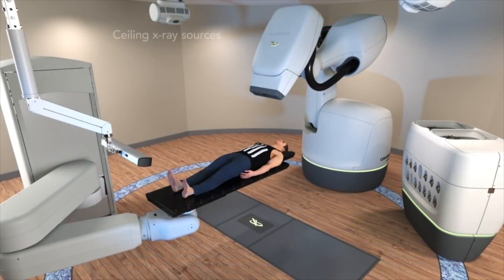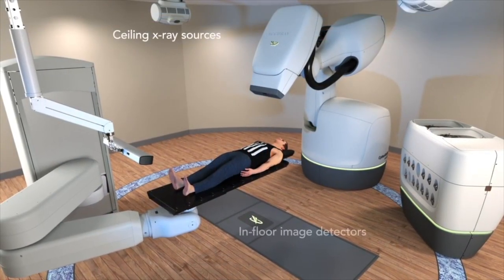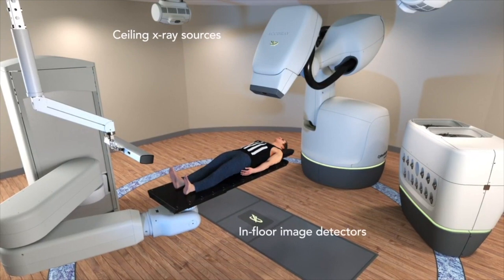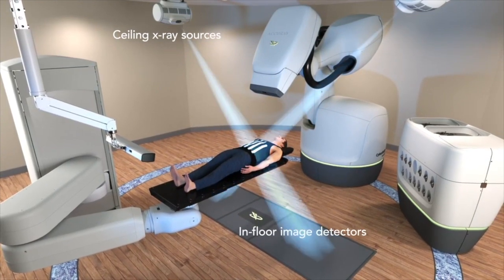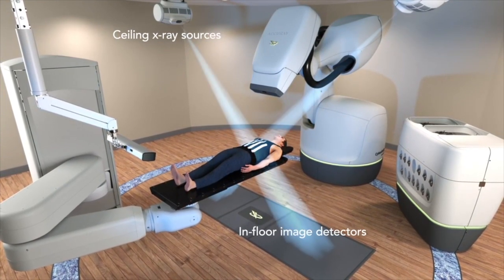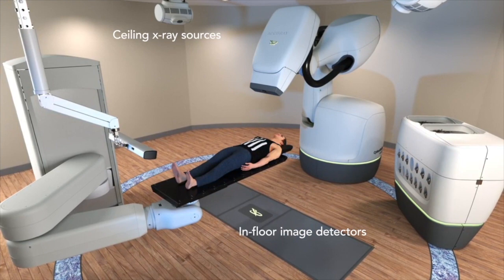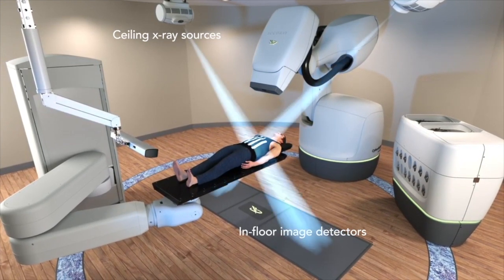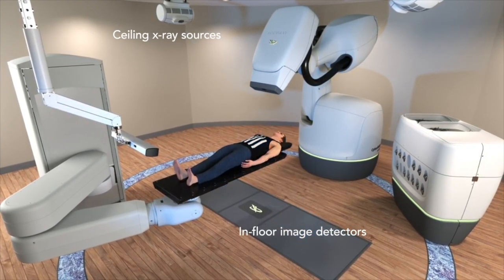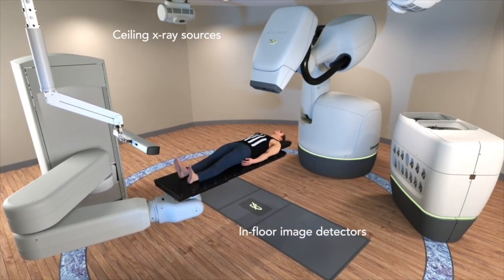The CyberKnife system's fully integrated image guidance system aligns the virtual projections to X-ray images taken prior to treatment delivery for patient positioning, and continually during treatment delivery for automatic beam correction.